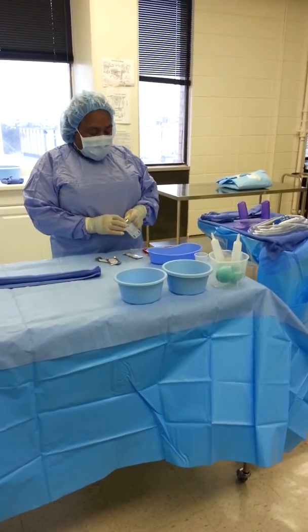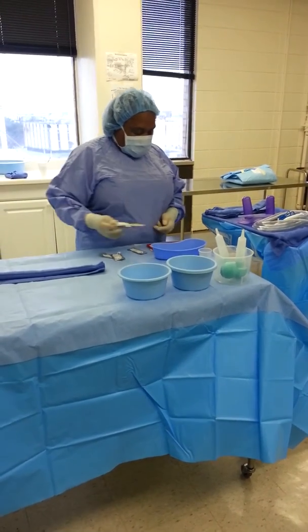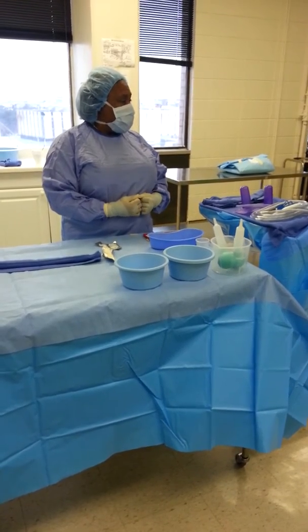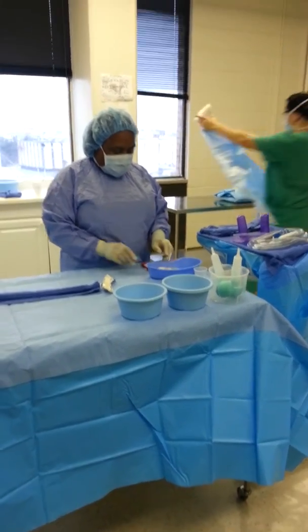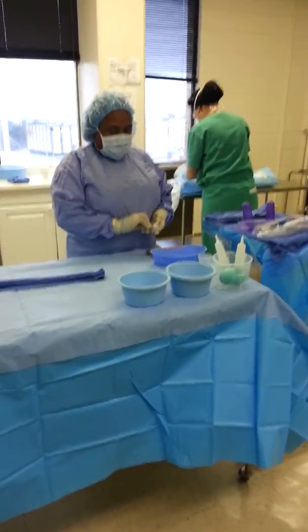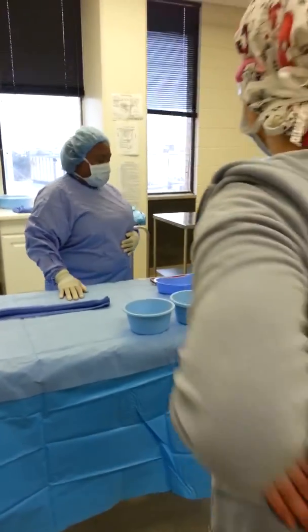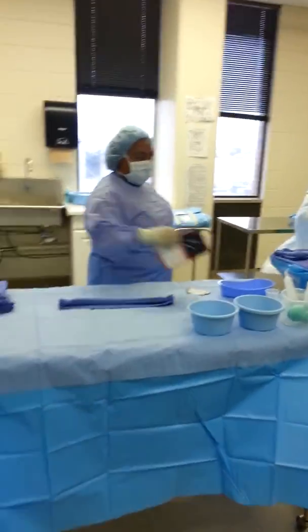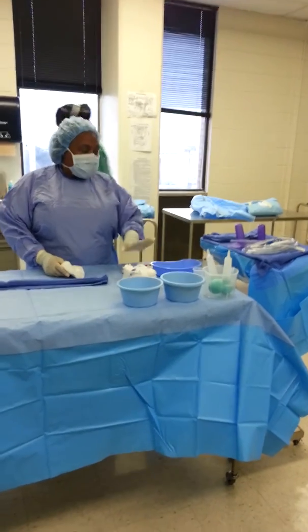I always peel my blades out to count, because I don't assume that's what's in it. So I need to make sure. And the needles won't come off of there because it's magnetic. So I'll tell my circulator I'm ready to count.